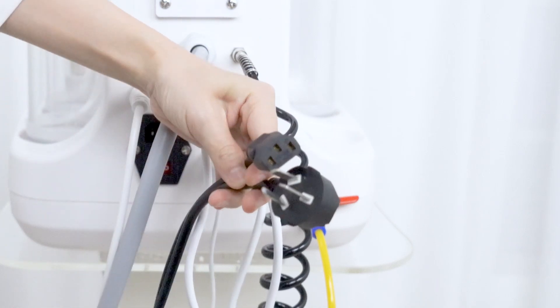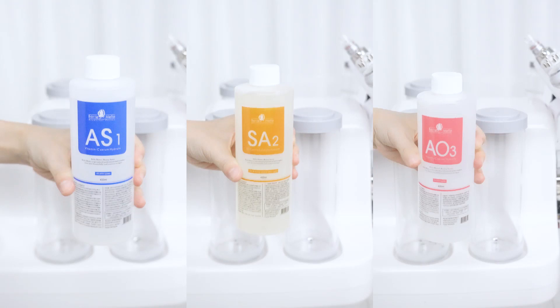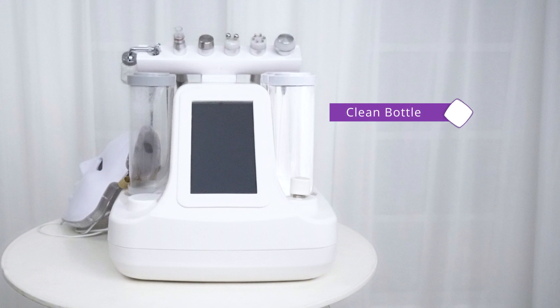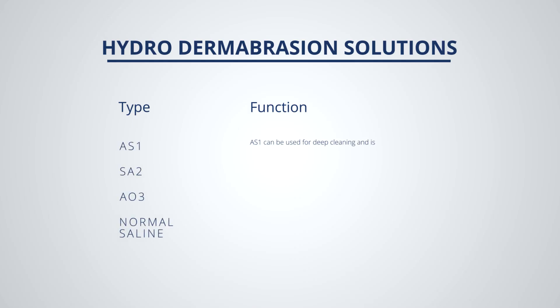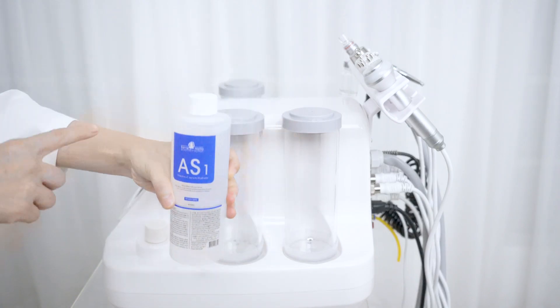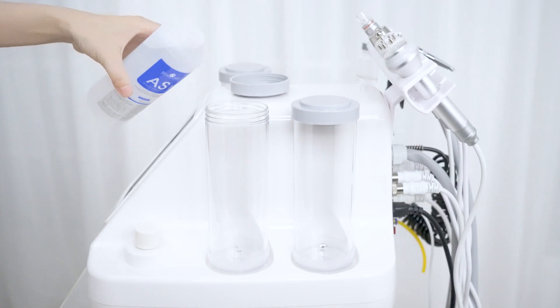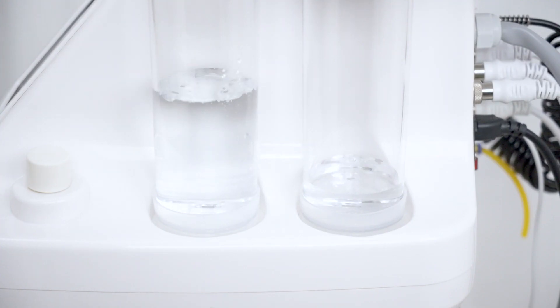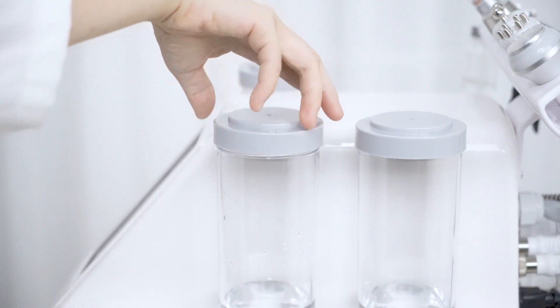Connect with power supply. Fill the bottles with solution. Twist open the clean bottle cover and pour in solution. There are two clean bottles and they are interlinked — when you pour solution into one bottle, both bottles are filled with the same solution, so pour in one solution only each time.